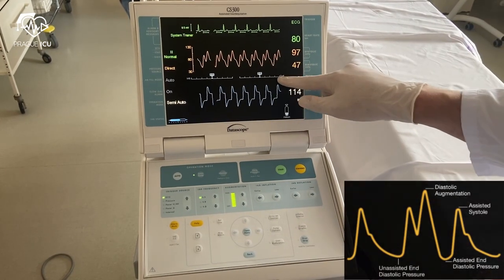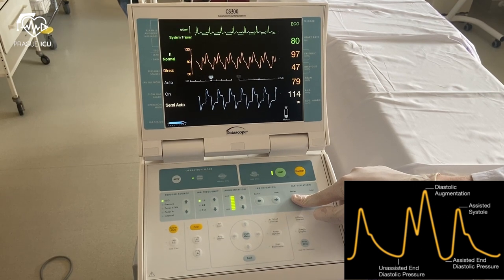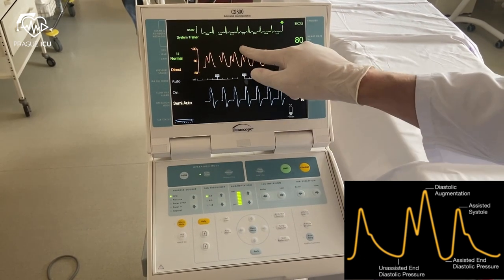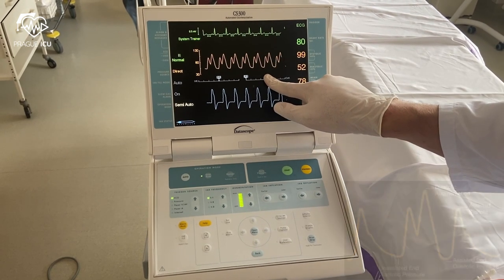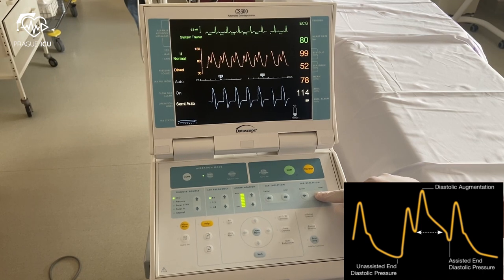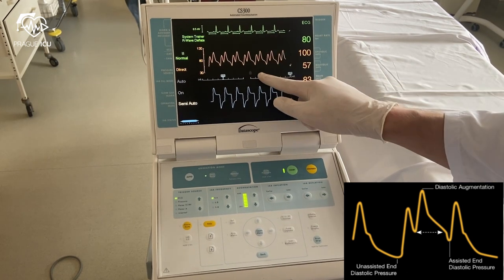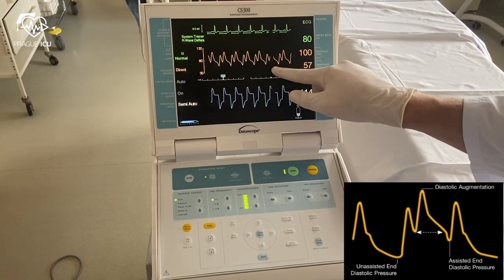In case of early deflation, premature deflation of the balloon occurs during the diastolic phase. Deflation of the balloon is seen as a sharp drop following diastolic augmentation. And finally, in case of late deflation, the balloon deflates after the aortic valve has opened. All above mentioned timing errors have deleterious physiologic effects.